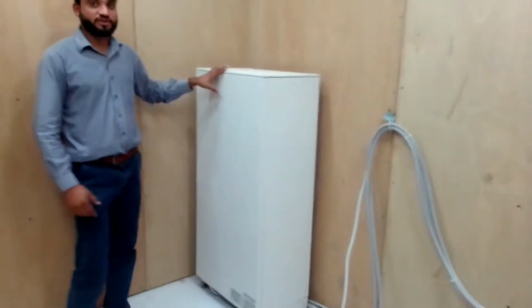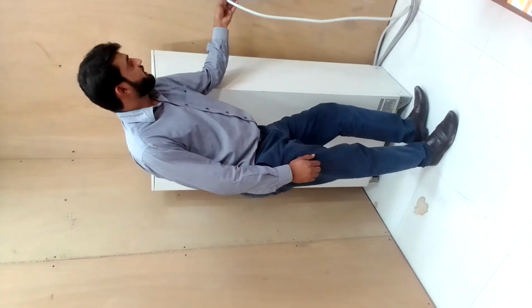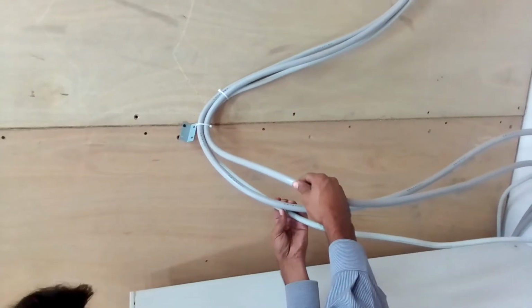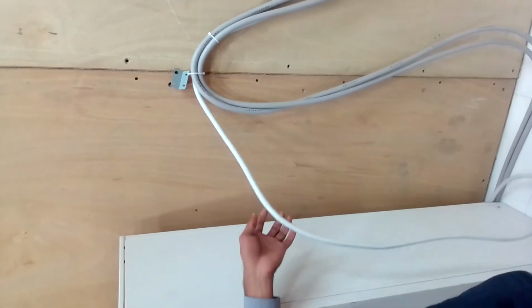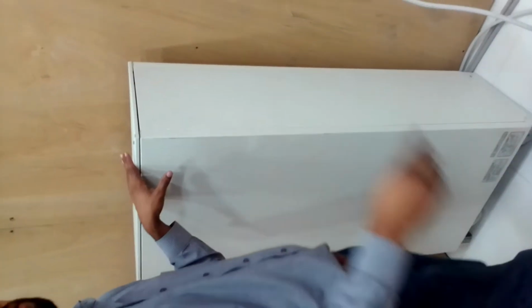Here is the generator of this Hitachi machine, and it's a 50 kVA generator, and this generator will give the power to anode and cathode. These two wires, one is an anode and the other is cathode, and this is for the rotating anode. This generator will help to give the high voltage DC current to the tube to generate X-rays.